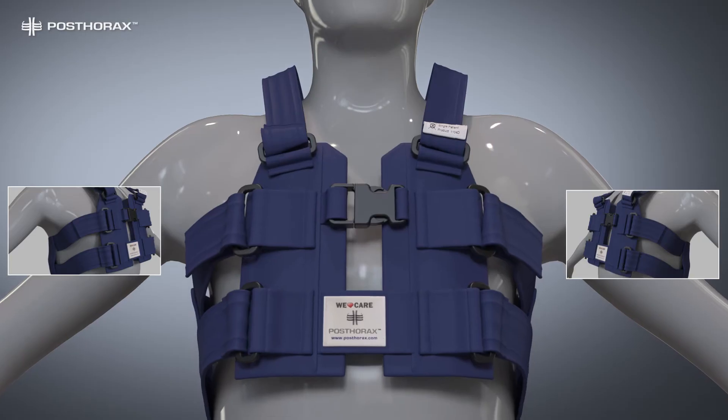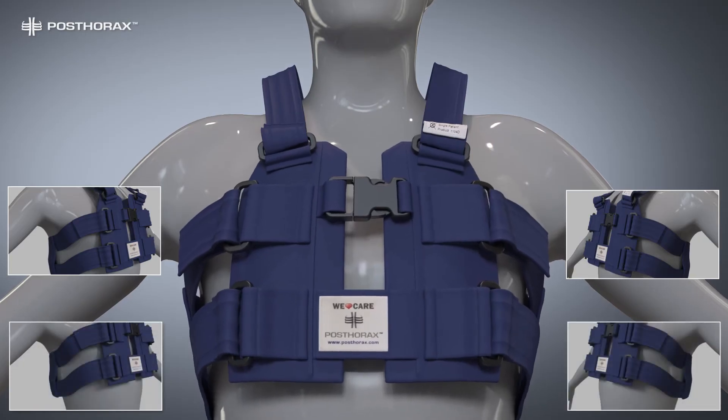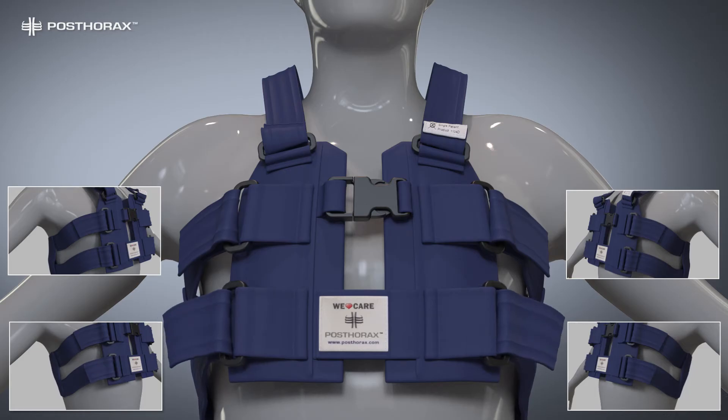When the patient exhales, the mechanics of breathing contract again. Repeat this process with the lower side straps.